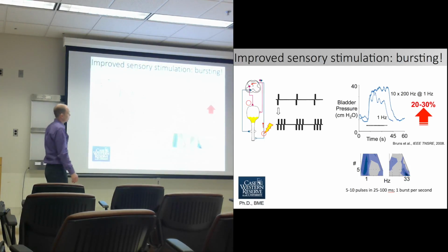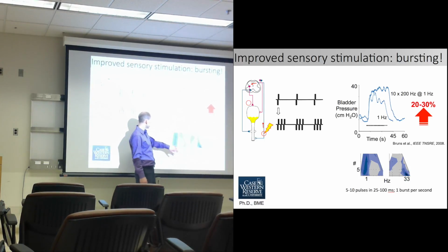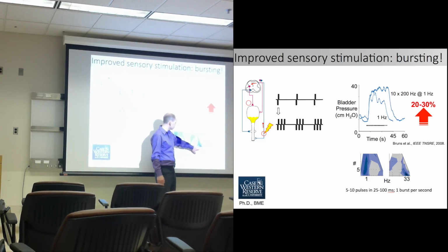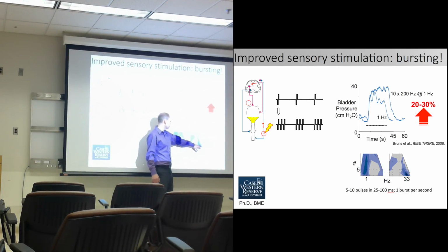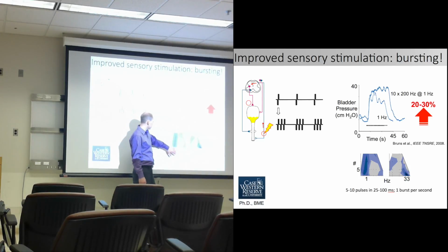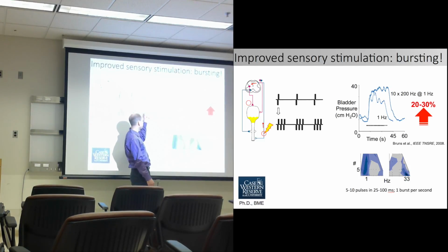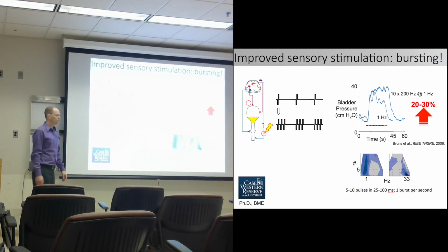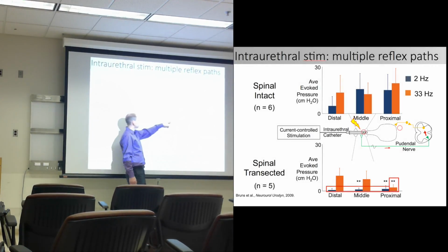We did experiments across, I think the paper published had 9 animals, and saw an interesting effect where some of them typically responded to what was known as the standard frequency range, around 20 to 33 hertz. If we added a second pulse, a kind of double-pulse stimulation, we got a significantly greater bladder contraction. But there was another group of animals that just preferred this lower frequency stimulation on the dorsal nerve, doing 5 or 10 pulses, giving a greater response. It's kind of bizarre to us why we have some low frequency responders and some high frequency responders.